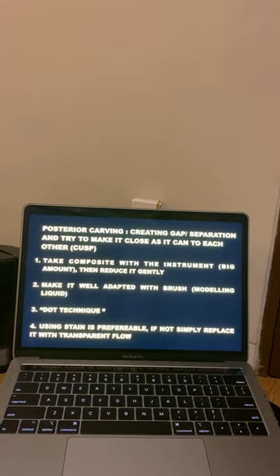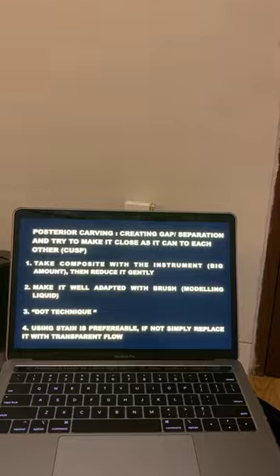No, I never use preheating composite. I found it very hard to carve the composite if you preheat it first.